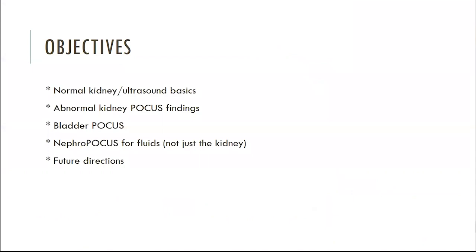So the objectives: we'll go over some normal kidney ultrasound basics, talk about some abnormal kidney findings, bladder findings, talk about other aspects of nephro-POCUS that's not just kidney and bladder, but looking at fluid status, and some future directions that may be coming down the line.